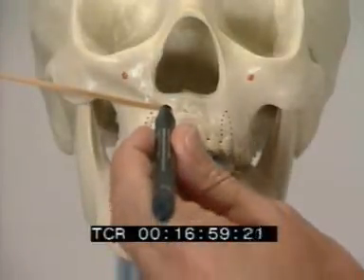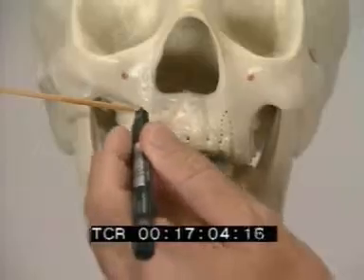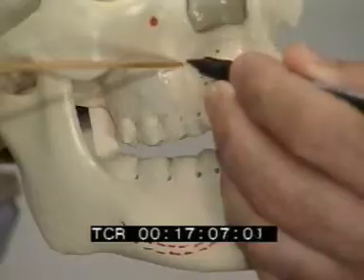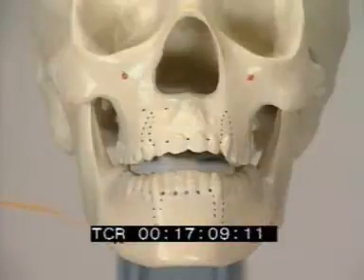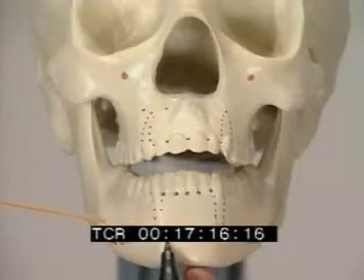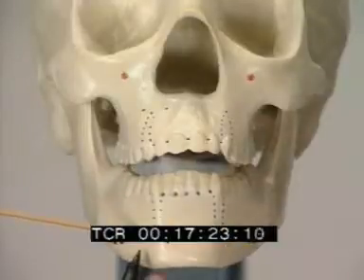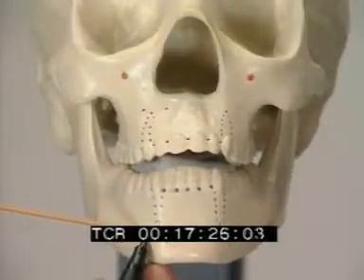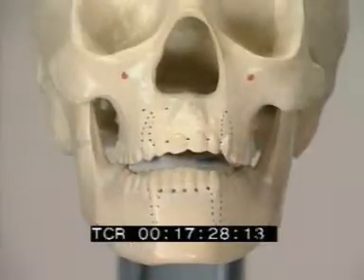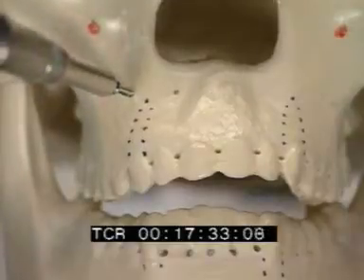For correct placement, IMF screws must be located superior to the maxillary tooth roots and inferior to the mandibular tooth roots, and are either lateral or medial to the long axis of the canine roots. A more lateral approach gives increased lateral stability and greater control over the posterior open bite, but it runs an increased risk of complications. The self-drilling and self-tapping screws can be introduced directly through the mucosa.